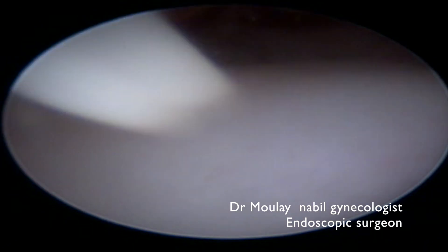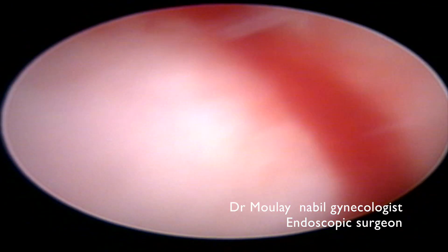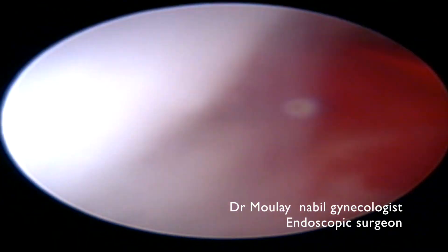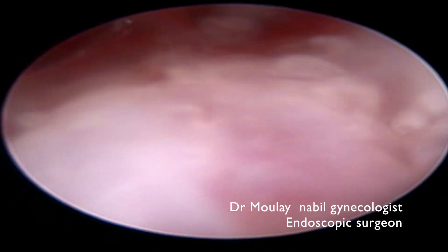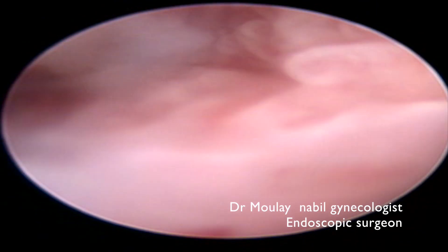We present a case of office ambulatory hysteroscopic IUD extraction after six unsuccessful attempts of IUD blind removal and two attempts under general anesthesia.